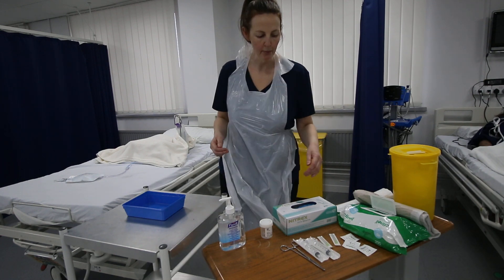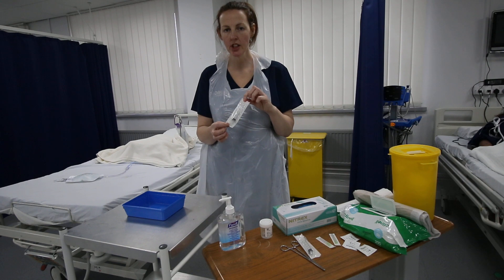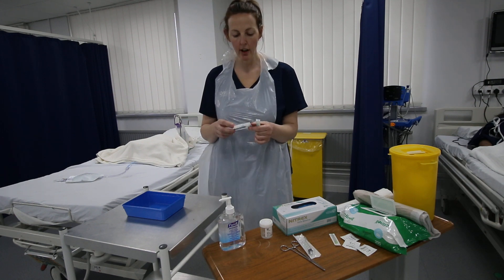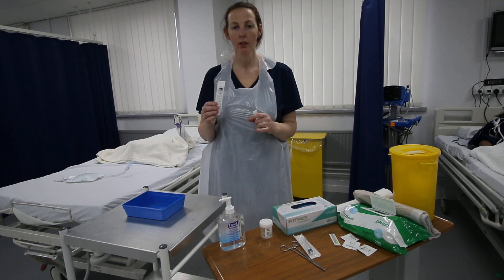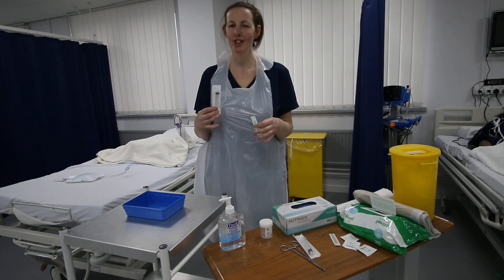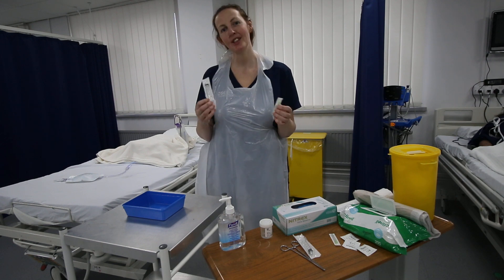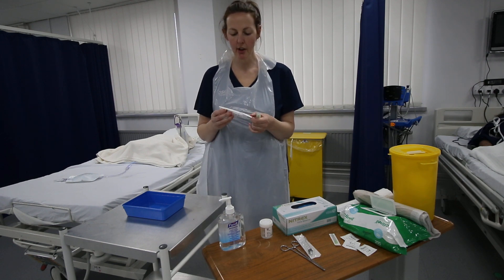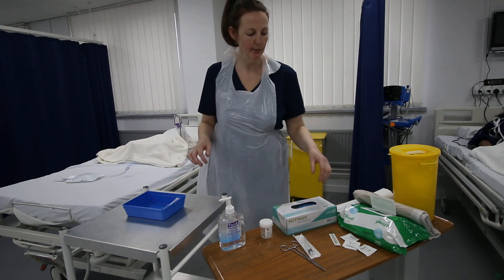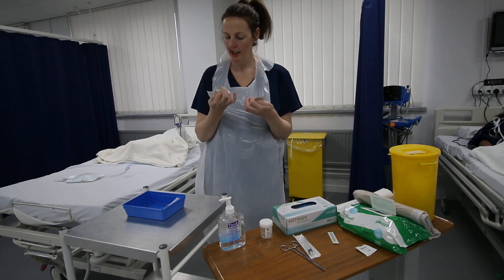I'm going to need a syringe — it's a 10 mil syringe, intact and in date. I'm also going to need a needle. Sometimes in the OSCE they have drainage bag ports with luer locks, so a syringe just clicks into the port itself. But sometimes we need a needle because older drainage bags require needle access to obtain the sample. So we're going to pretend this is an older port. I've also got two 70% alcohol swabs, both in date — expiry 2023.